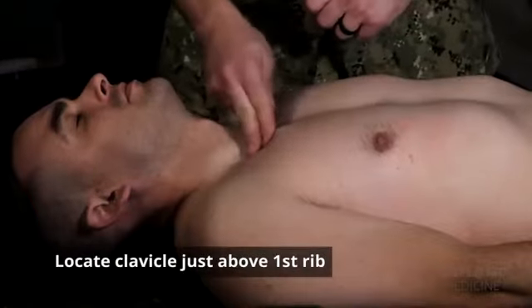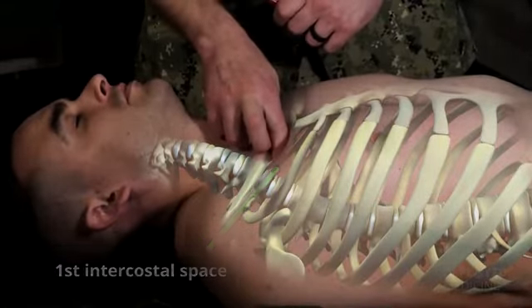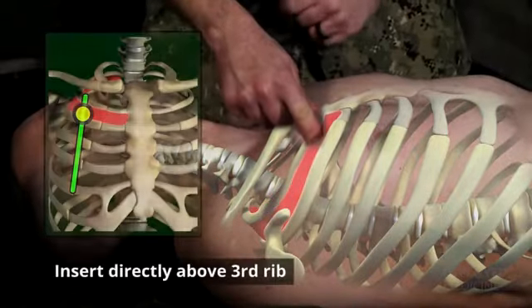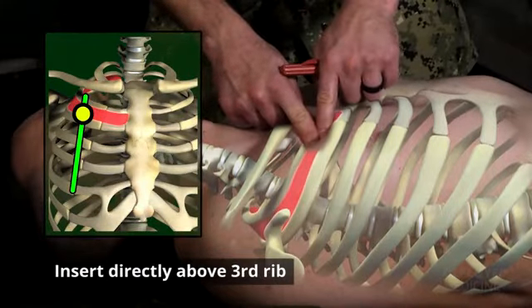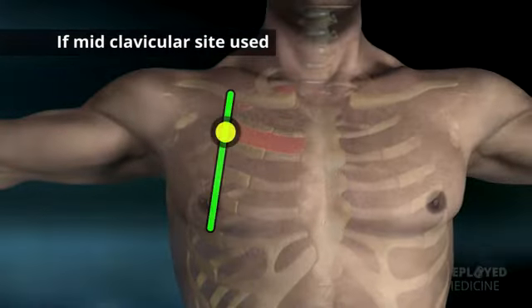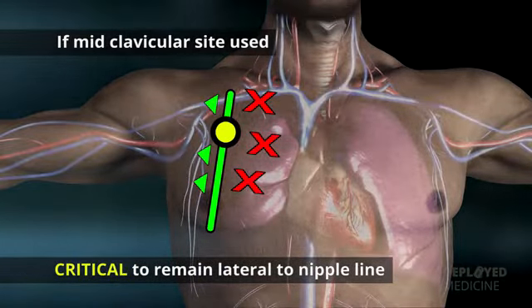I want to locate my patient's clavicle, which is also right above the first rib. Underneath that is the 1st intercostal space. Moving down, I find the patient's 2nd rib. Underneath that is the 2nd intercostal space. I'm going to insert my needle catheter here, directly above the 3rd rib, so that I don't hit any arteries or veins along the bottom of that 2nd rib. If the anterior MCL site is used, it is critical to remain lateral of the nipple line to avoid the heart and large blood vessels.